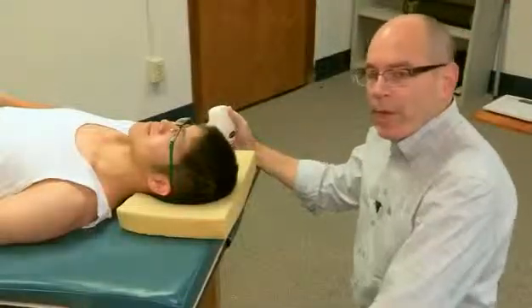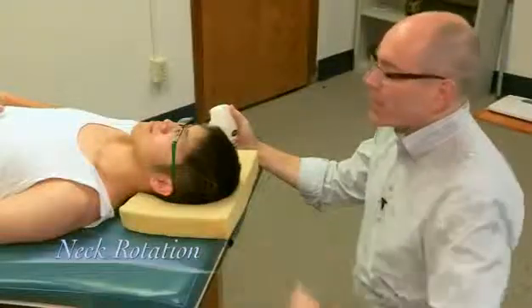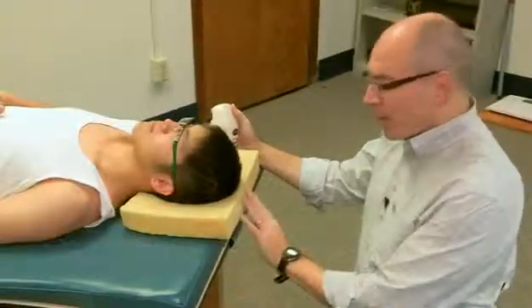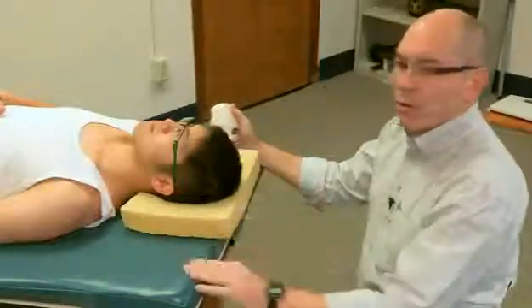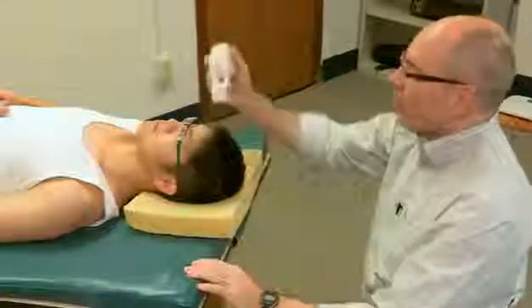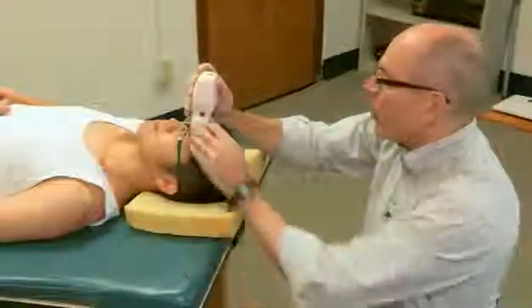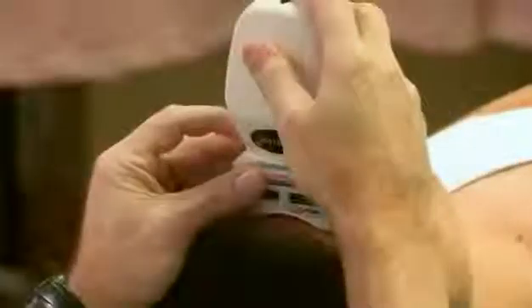We're going to begin by measuring neck rotation. We do this with the individual lying supine, that is on his back. I've placed a slight support under his head just so his forehead is a little flatter to accommodate the inclinometer. I'm going to start in this position and rest it on his forehead, then set it.